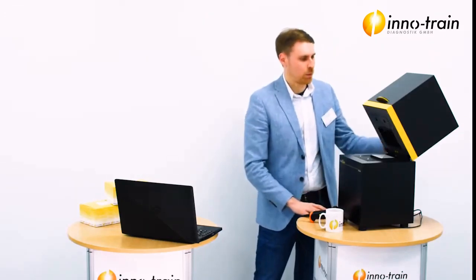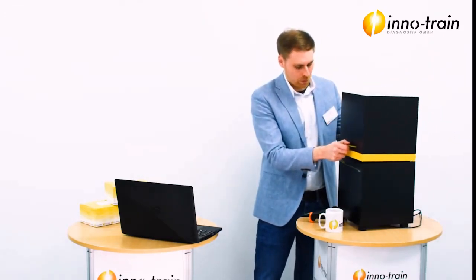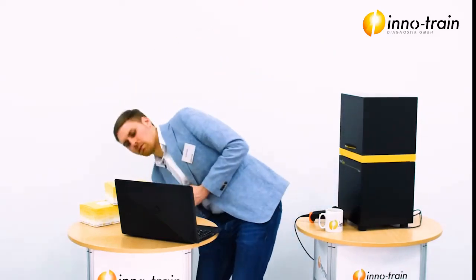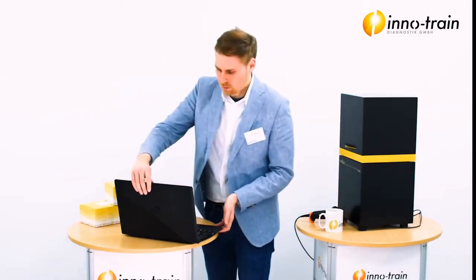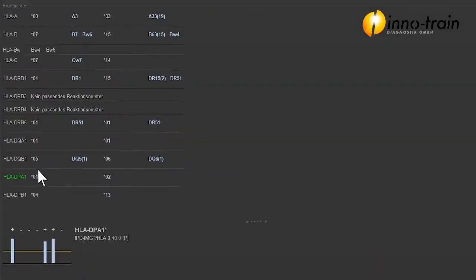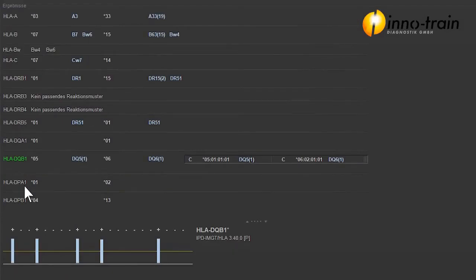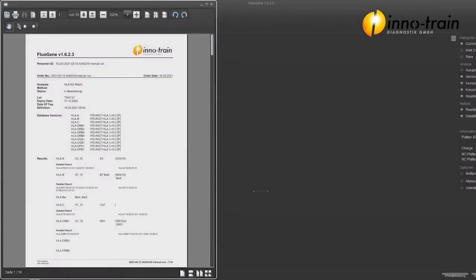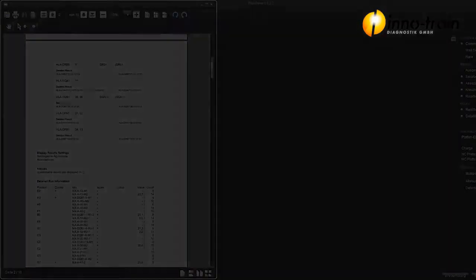This plate we don't need anymore, so we remove it. You can trash it now, it's perfectly sealed. And I will continue to show you how the FluoGene software works. For example, you can see the summary of your typing, or you simply print the result. That's it, easy as it can be.